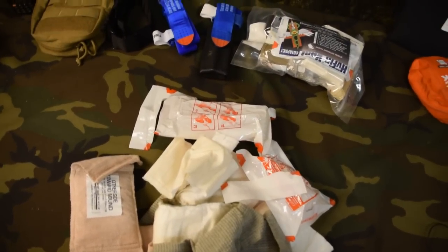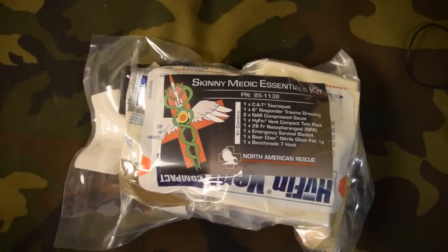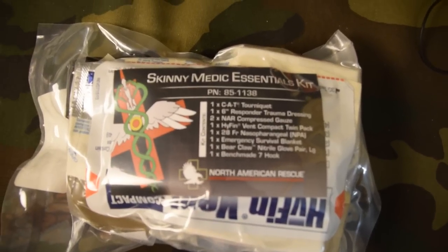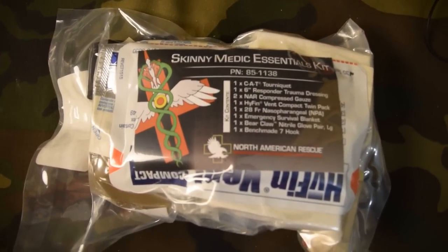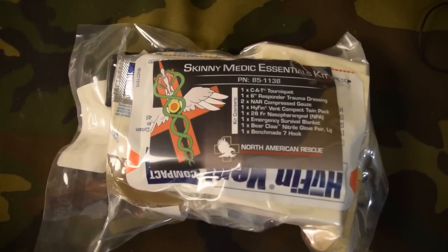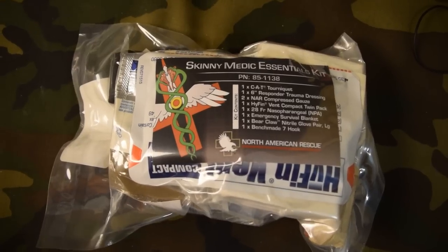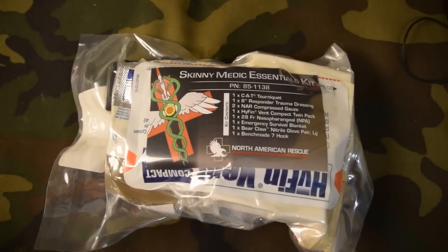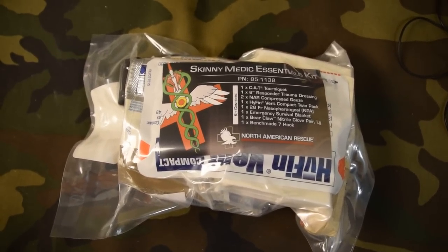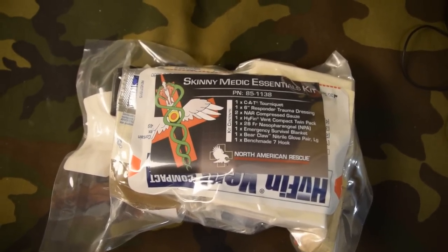I hope this video helps — you never know when you'll be the first responder, so remember the right gear and the right training. If you stuck it out this long, here's a quick sneak peek of my new kit, which is already available on the website. You can see a CAT tourniquet, six inch pressure bandage, two compressed gauze, two HyFin chest seals in a twin pack, an NPA, an emergency mylar blanket, a pair of gloves, and a Benchmade 7 Hook — which I'm really excited about. Benchmade has a lifetime warranty, so if you break it they'll replace it. I'll do a complete review soon.